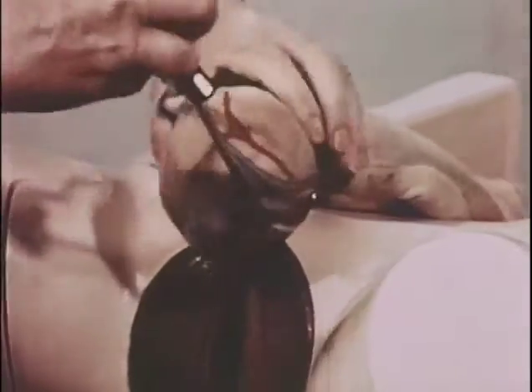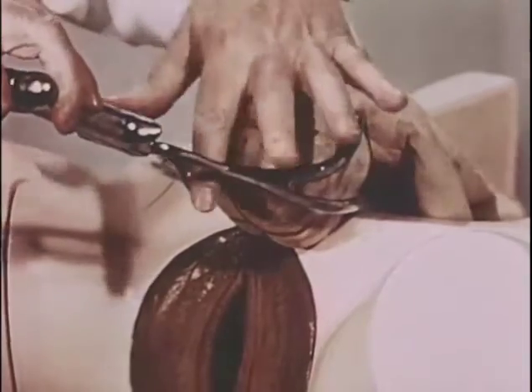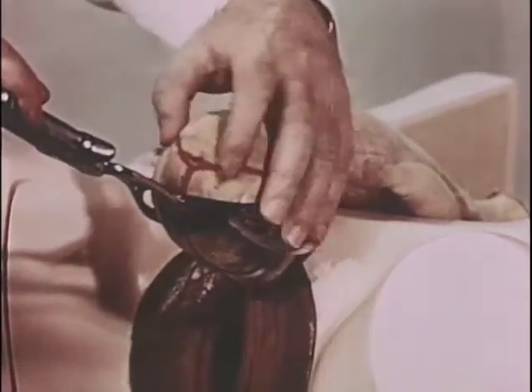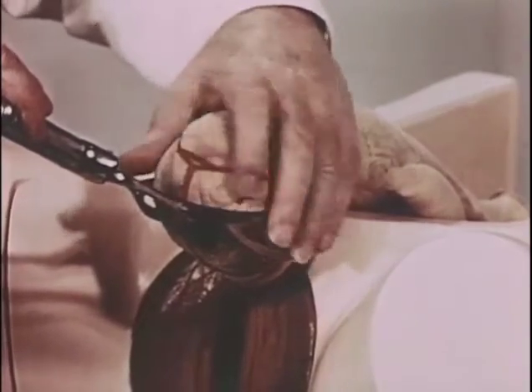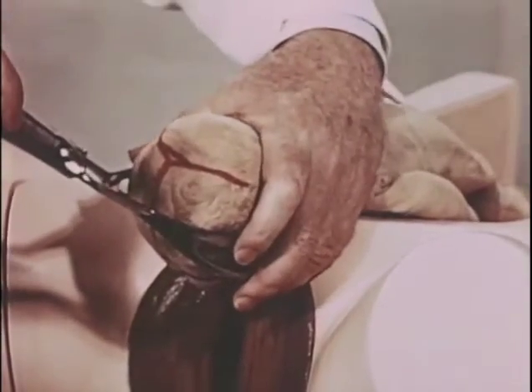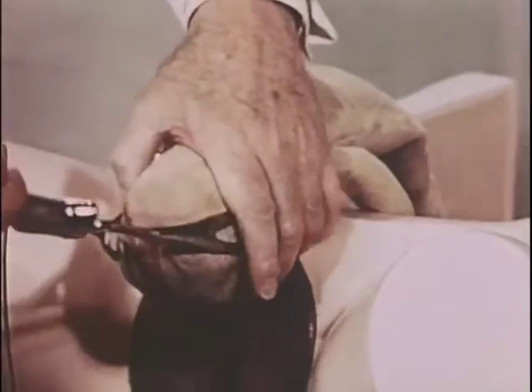The sagittal suture runs obliquely to the perpendicular of the middle of the plane of the shanks, and the Y is closer to one side of the blades than the other. Here we have the brow mastoid application. That anterior blade is over the posterior brow, and the posterior blade is over the posterior mastoid region.